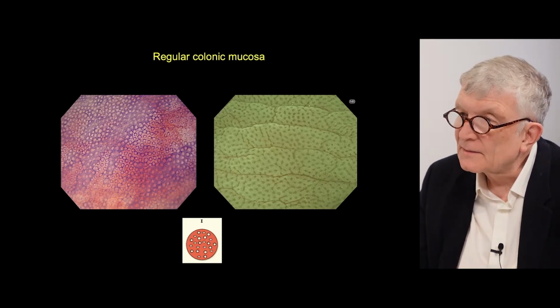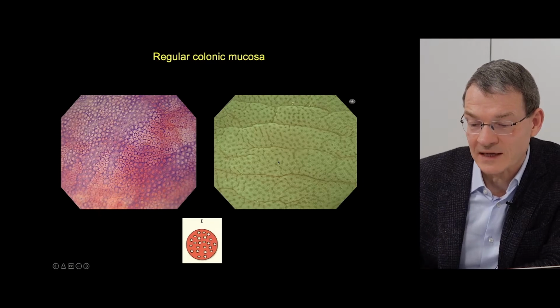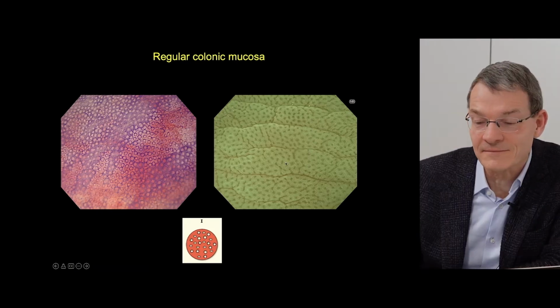Exactly, because I think vinegar makes a little bit more swelling of the parenchyma, and that's why there's a swelling of the little holes. Exactly. Okay. Yeah. Good.